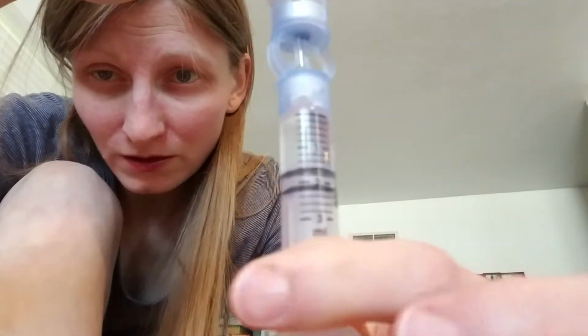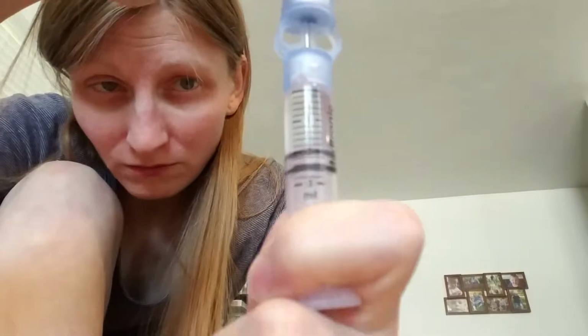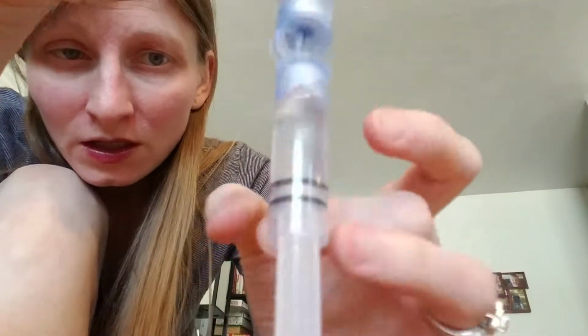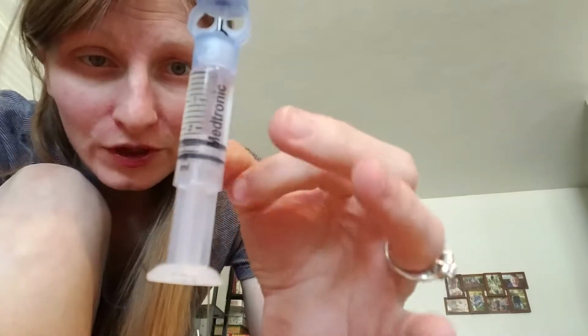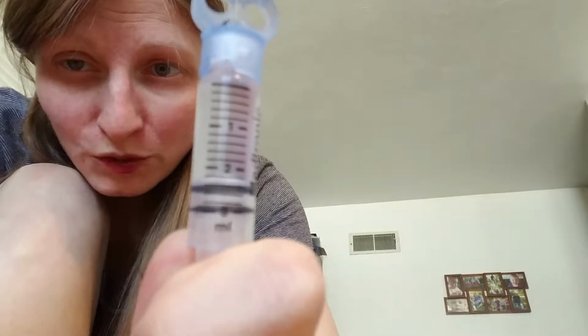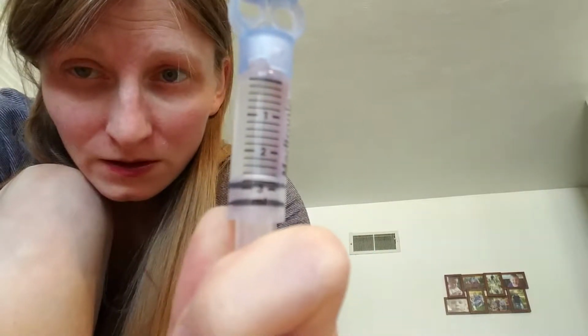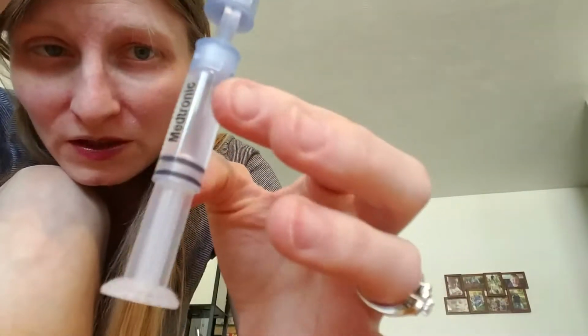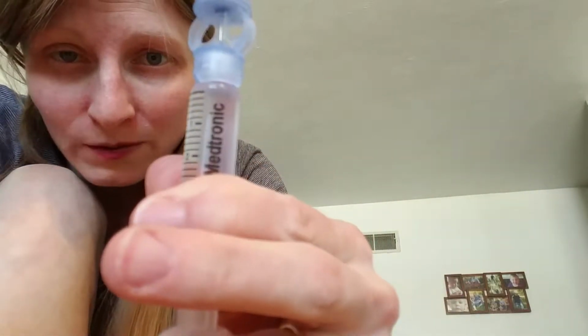And then pull the plunger down. Still seeing bubbles. Yep, there they go to the top. When the insulin is cold, you actually get more bubbles. So this stuff I did not have in the fridge. The fridge does help keep it preserved so that it's not degraded by the heat, making it less effective. That's always fun when you're trying to troubleshoot and figure out why your blood sugar's high, and there's dozens of different reasons it could be. One of them being your insulin's not being effective because it's been destroyed by heat.